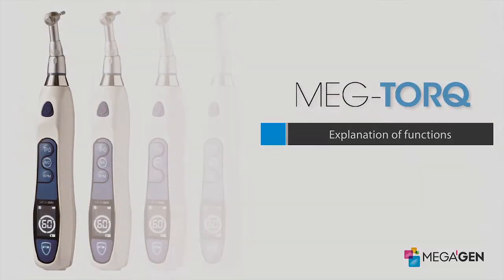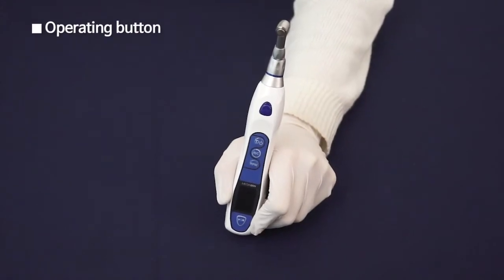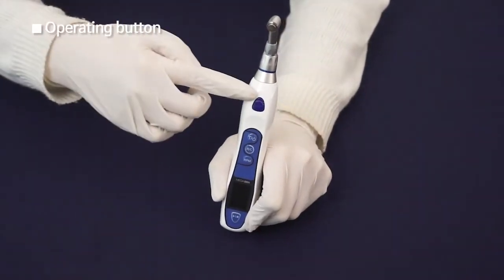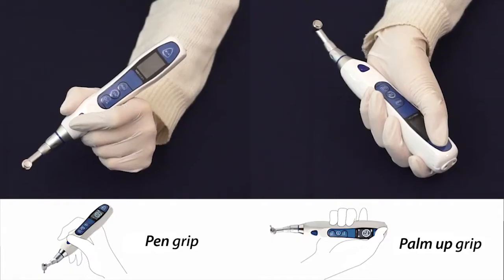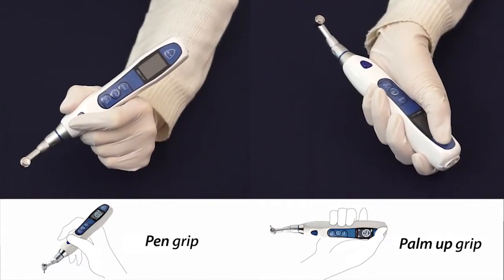Explanation of Functions. The Operation Button is on the top and bottom of the motor handpiece for comfortable grip, regardless of the position. There are two ways to grip: pen grip and palm up grip.